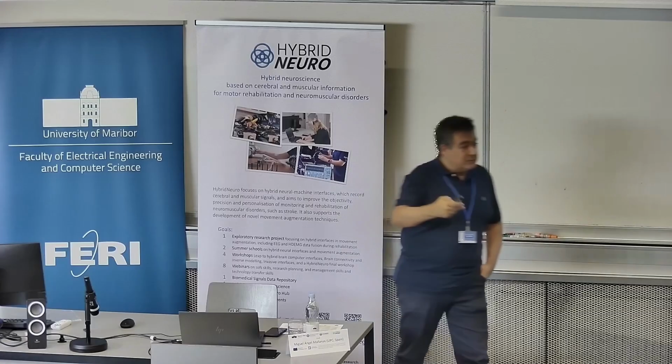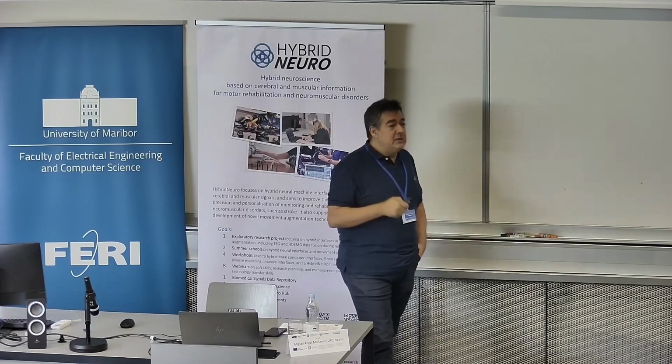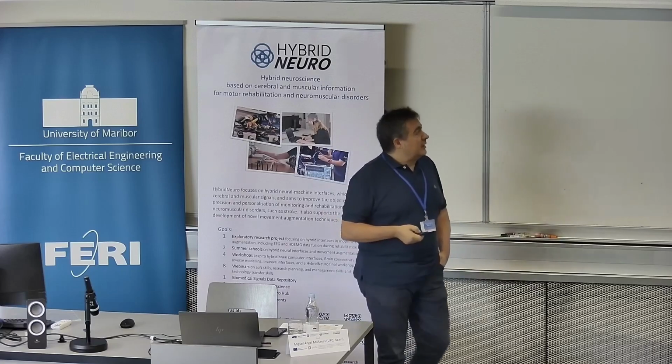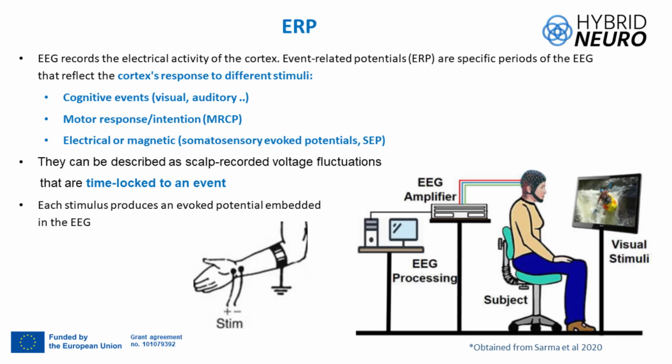Even when the patient arrives at the hospital, it is possible to monitor this potential in the brain in order to know if this patient must go directly to the surgery room, because you know the timing is crucial in stroke patients. So these potentials come as a response to a stimulus. So you have to analyze this potential time-locked to an event. This time-locking must be to the stimulus or even the response. Okay, we will talk a little bit later.